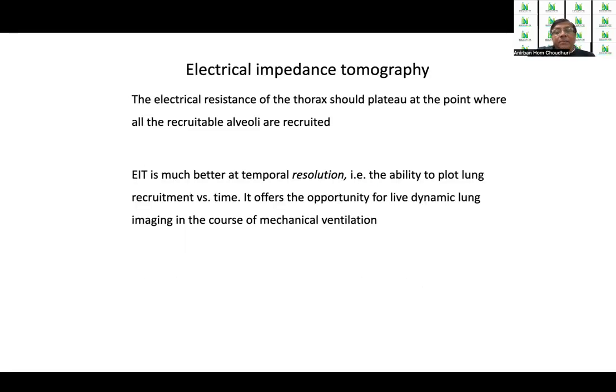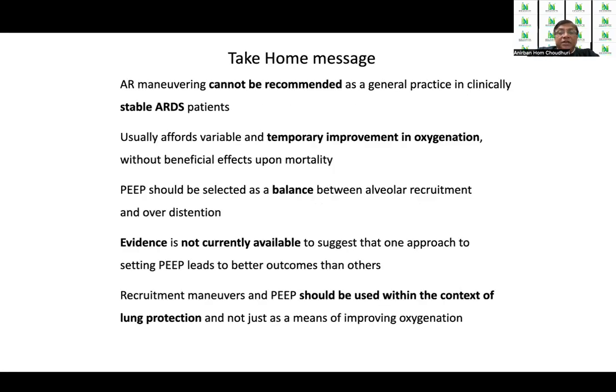Another is electrical impedance tomography. The electrical resistance of the thorax should plateau at a point where all the recruitable alveoli are recruited. So this electrical impedance tomography is much better at temporal resolution, that is the ability to plot lung function or the lung recruitment versus time. It offers the opportunity for live dynamic lung imaging in the course of mechanical ventilation.